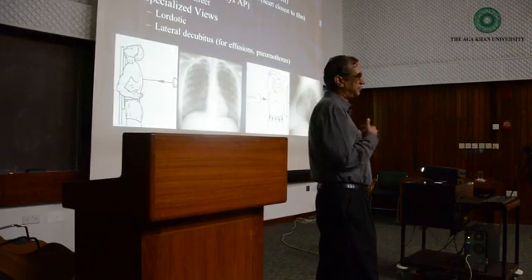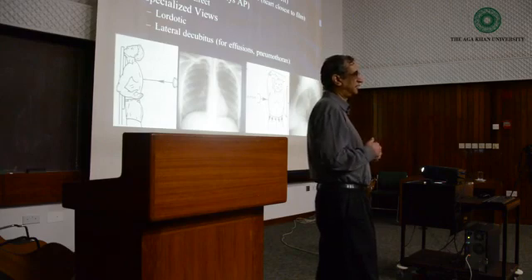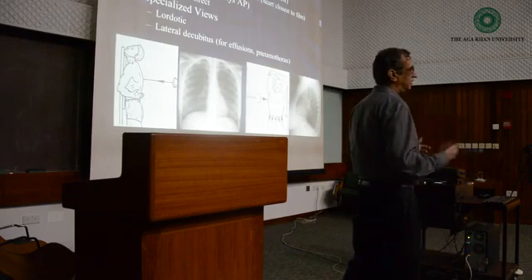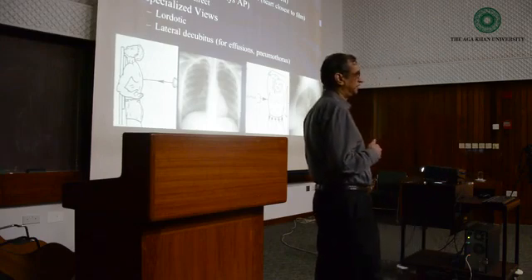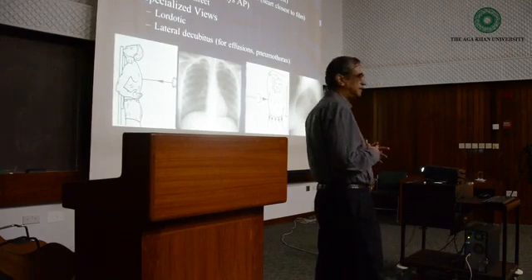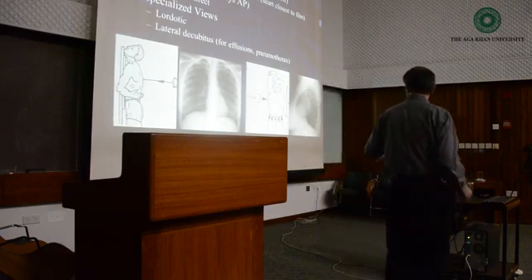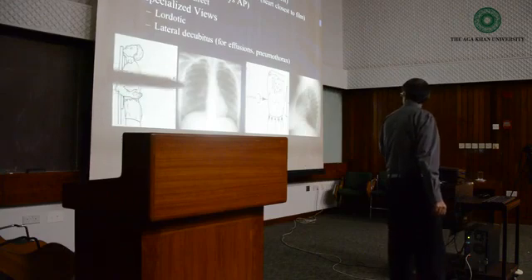Lungs are anterior as well as posterior. So it doesn't affect the lungs very much. Ribs are also curved. They are both anterior as well as posterior. So it's the heart which is anterior. And that is the image. That's the image which we get.